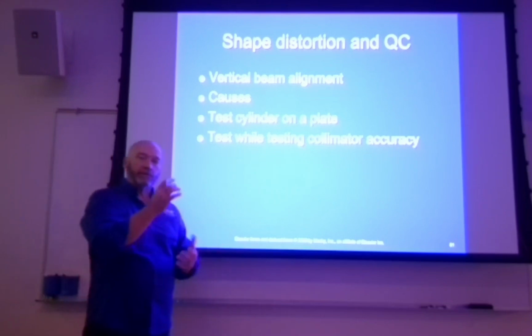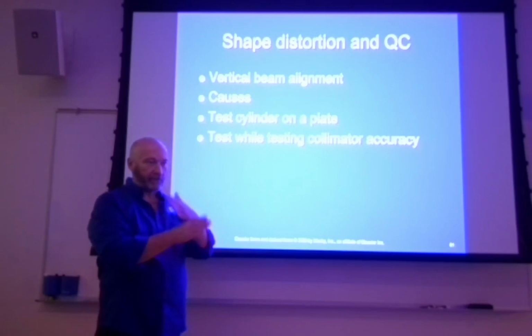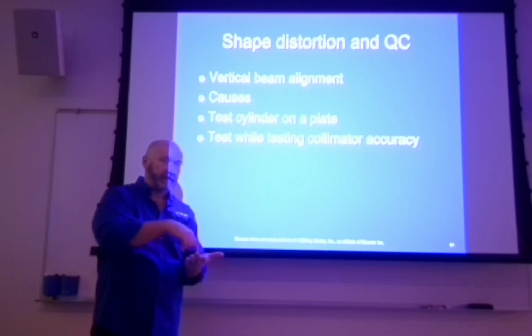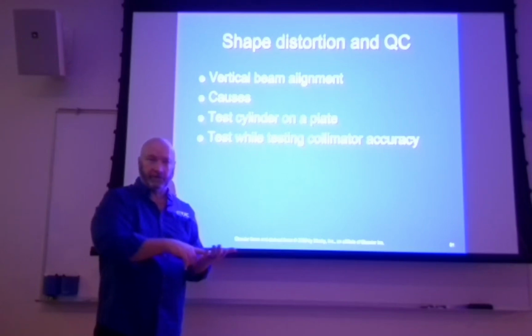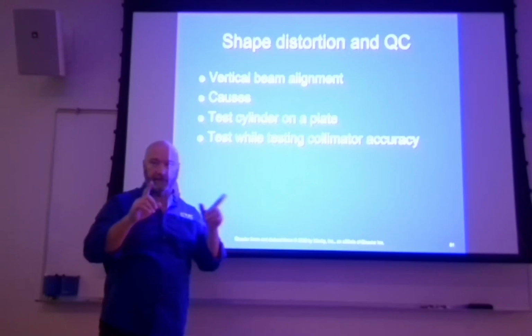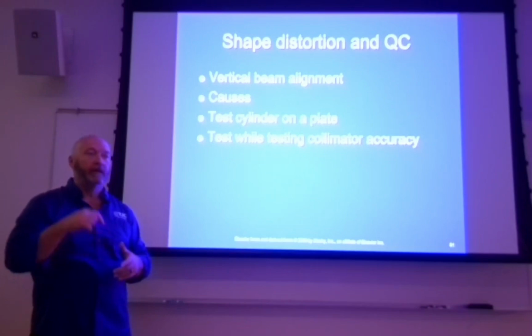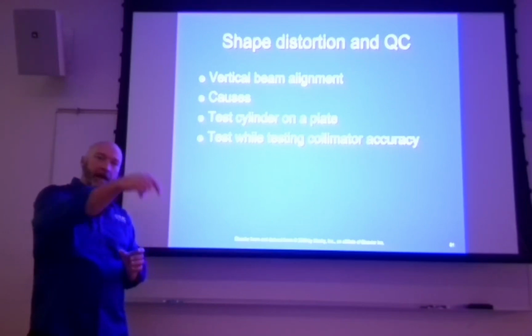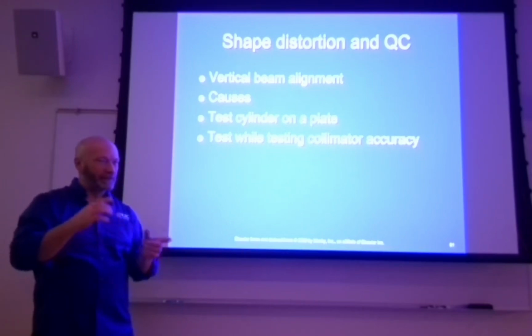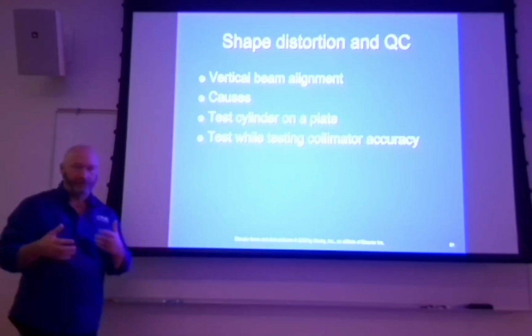So what you do is you put the cylinder directly on the crosshairs of this template, and you make an exposure, and if it's outside that second circle, then your x-ray tube is tilted in one direction or the other. Even if the angulation indicator shows 0, it's still tilted a little bit, and it's projecting that top hole out of regulations. Okay, does that kind of make sense without seeing the exact tool? Kind of makes sense of what I'm trying to get at.